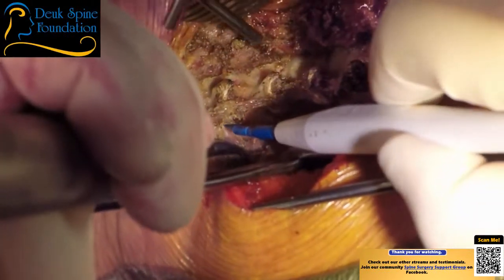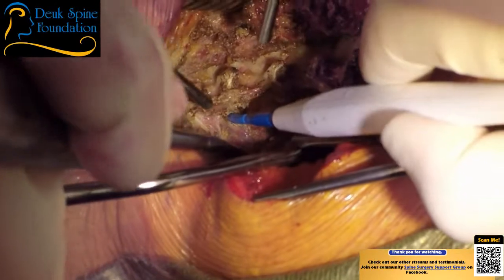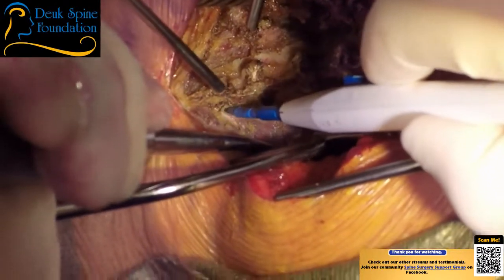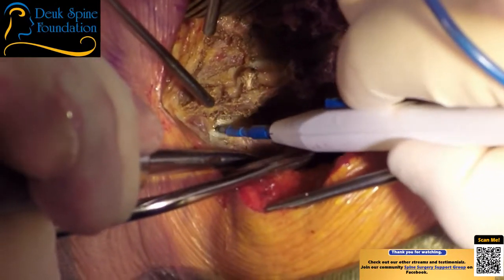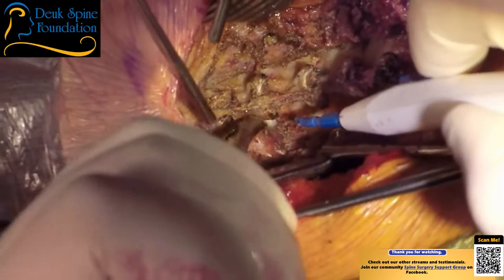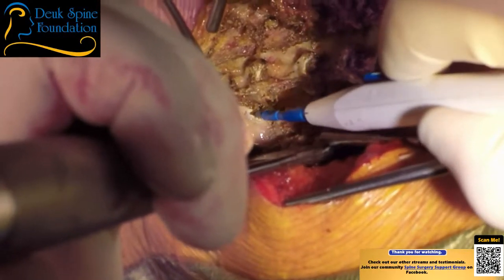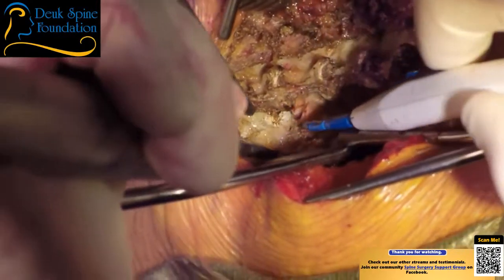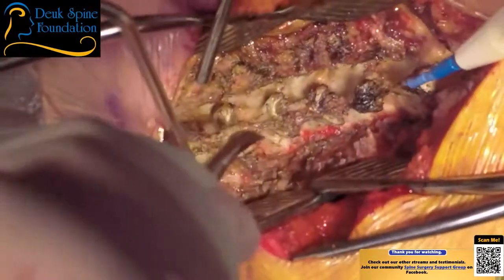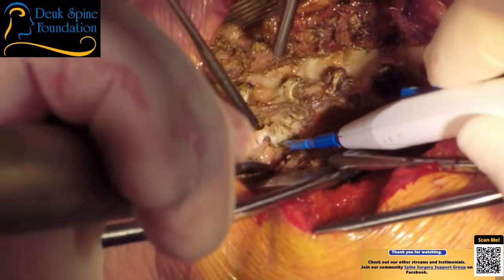One of our viewers is wondering, will you be using a transitional rod if you're going down to T2, or just a 3.5 rod all the way down? No, we're not going to use a transitional rod. The screws that we're going to put in the thoracic spine, the T1 and T2 pedicle screws, are going to be able to accommodate the same rod as the lateral mass screws. It's from the same system, and they're all basically the same screws.